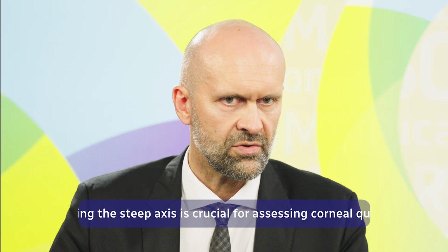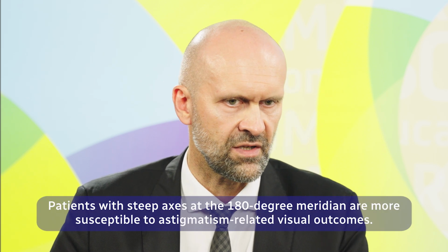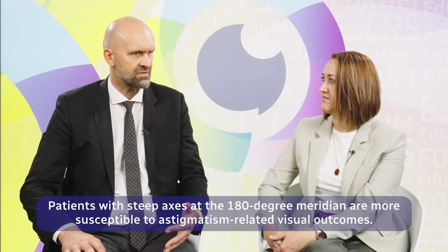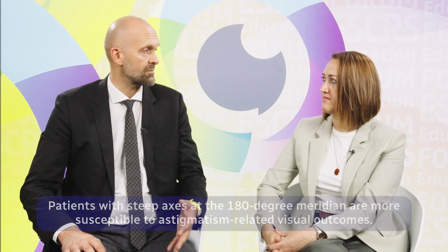It really is. I don't think everyone understands that even a half a diopter of astigmatism can have a significant decline in visual quality. So can you tell us a little bit about the impact of different types of astigmatism? What are you looking for and how do these impact the vision? So generally we know that if you assess the corneal quality, it's pretty important to know the steep axis, because in patients with steep axis within the 180 meridian, we see that there's more dependency on the potential role of astigmatism on the final outcome, especially when it comes to multifocals.